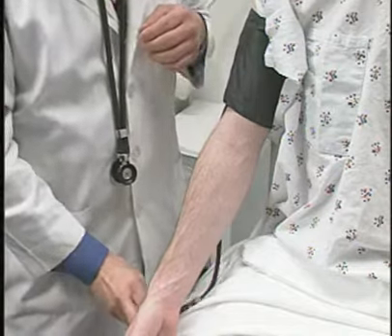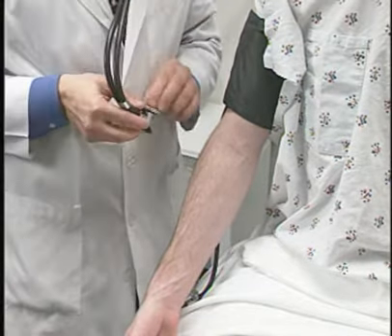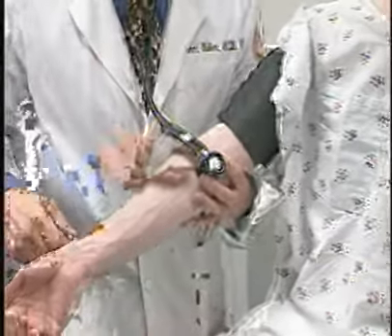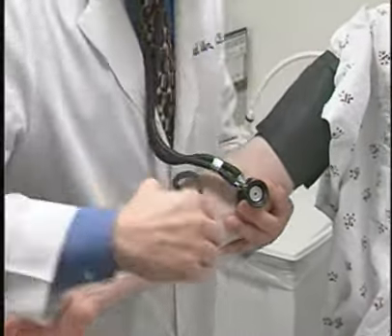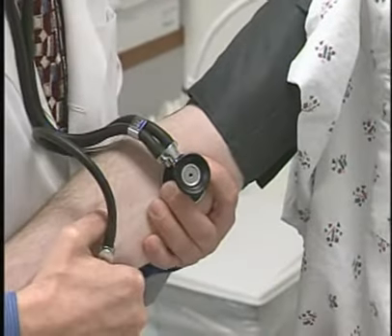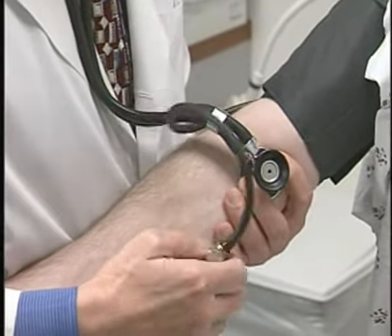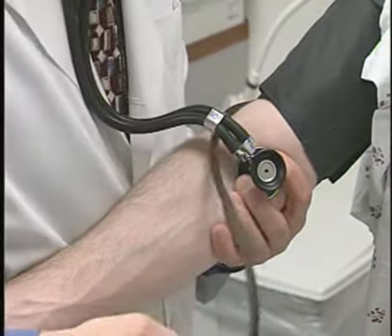So when I go to auscultate the blood pressure, I know I only need to auscultate above about 20 millimeters of mercury, approximately 110. I don't need to blow the cuff all the way up to 200 and hurt his arm. You notice that the brachial artery should be about at the level of the heart, but the patient's arm should also be relaxed, so you as the doctor should be the one holding the arm up. Don't ask the patient to hold their arm up, because that again can falsely elevate their blood pressure.